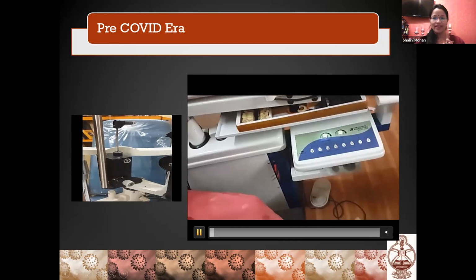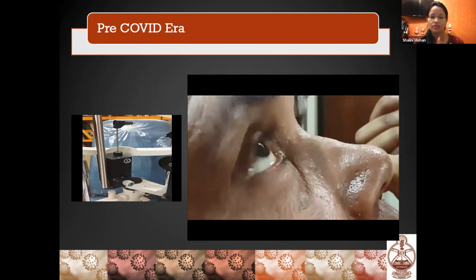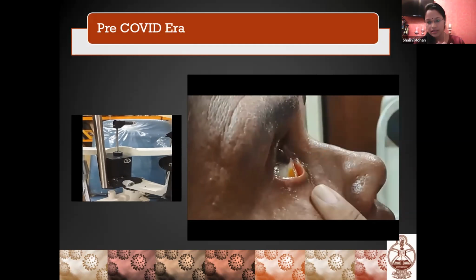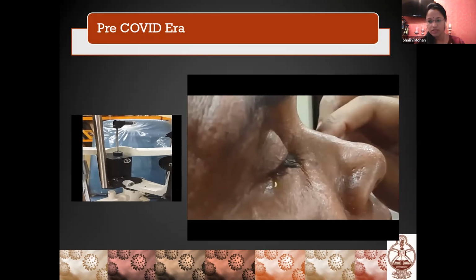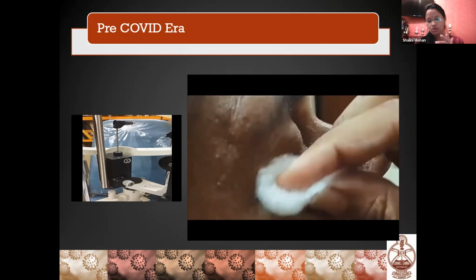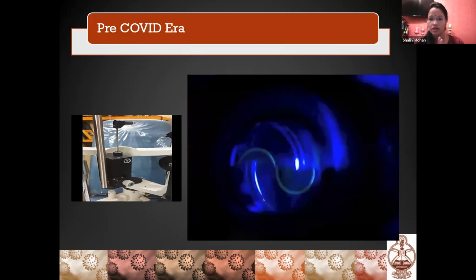Now this is a video. This is from the pre-COVID era, so we are touching the eyelids, but ideally in the COVID era, you should touch them with the help of buds. Then you put the fluorescein dye inside the eye. If there is excess fluorescein dye, always clean it with the help of cotton. In the COVID era, you need to wear gloves to do the procedure.